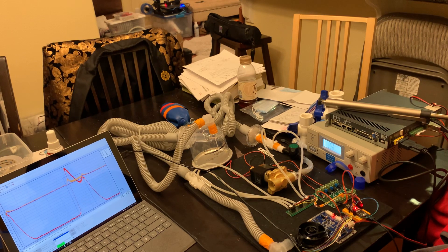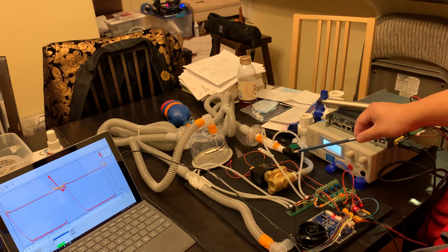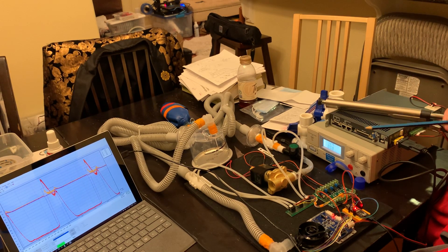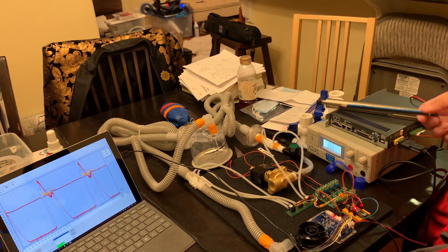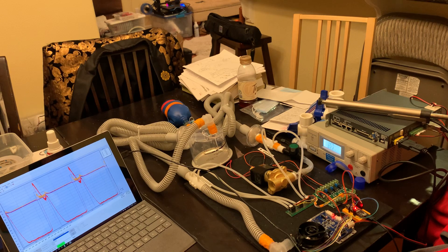First of all, we have the outlet solenoid, which we have added. This solenoid helps the ventilator to conserve oxygen. Without the solenoid, the ventilator wastes about 75% of the oxygen that it takes in, so having the solenoid makes a really big difference.